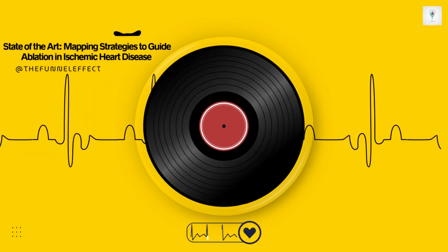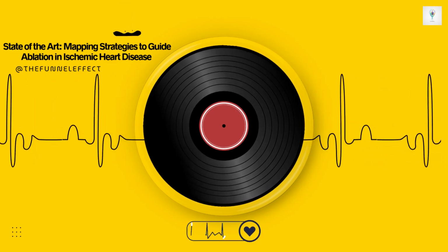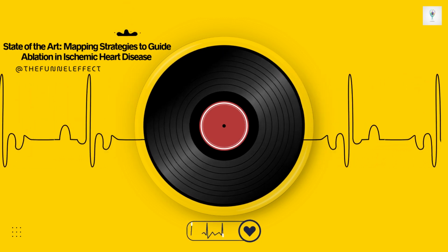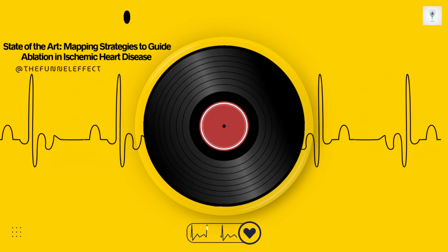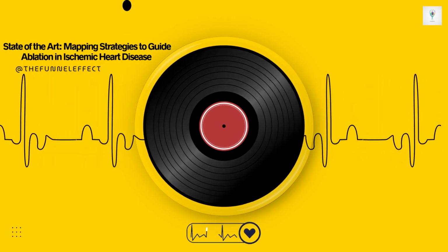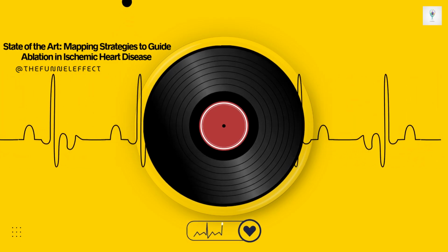Exactly. And this is usually the preferred starting point, especially for patients who are higher risk. Maybe they have really poor heart function, a low ejection fraction, or massive scars. Trying to deliberately trigger VT in those patients can be really risky, hemodynamically unstable. Substrate mapping lets us try and neutralize the hidden dangers while the patient is stable. Like mapping the blueprint of a bomb without actually setting it off? Okay. And the second main strategy?